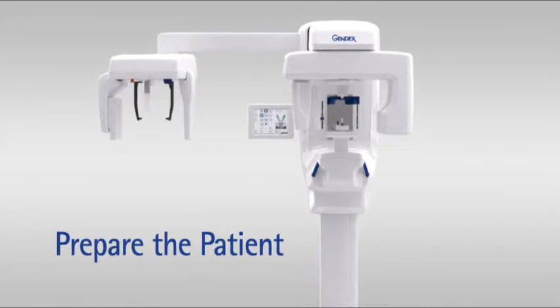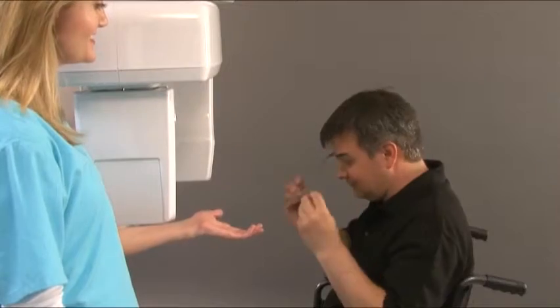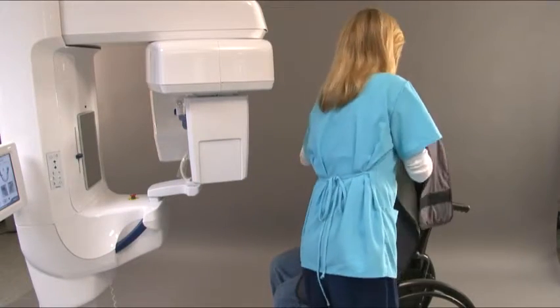Prepare the patient. Ask the patient to remove any glasses, false teeth, jewelry, hair clips and pins. Place a protective lead apron over the patient's shoulders.